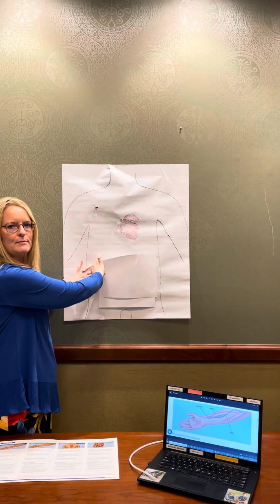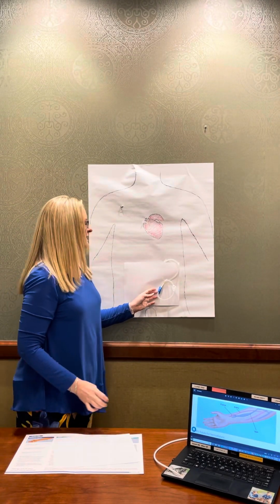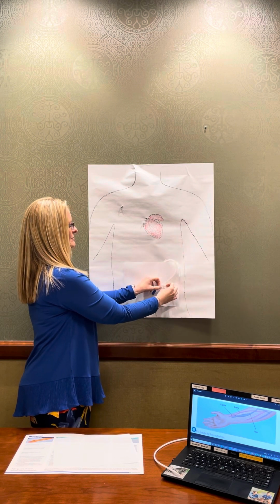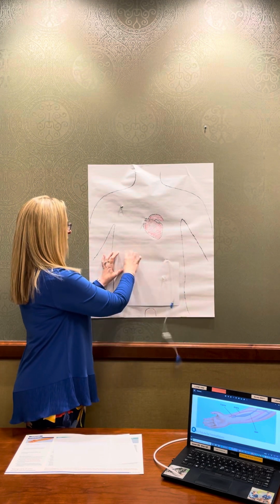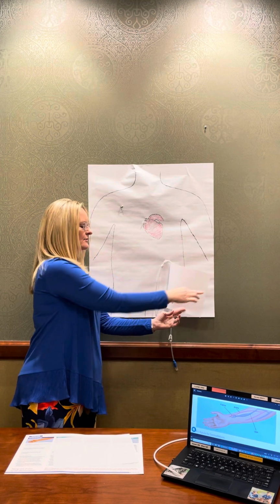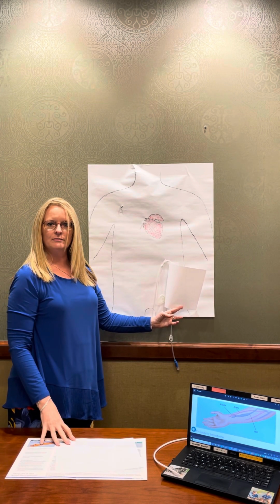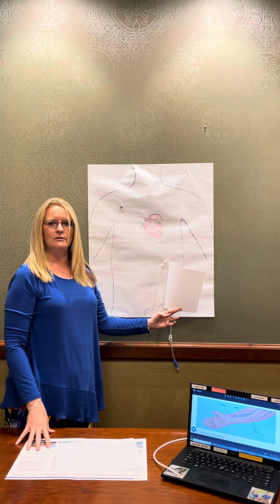We have what is called a peritoneal catheter. This catheter is implanted in the body where we have this segment that is exposed. Inside the body is the remaining piece of the catheter. It hangs down inside the abdominal cavity. Using a peritoneal catheter does not involve the bloodstream and does not involve needles. So for some patients, this may be the ideal choice.